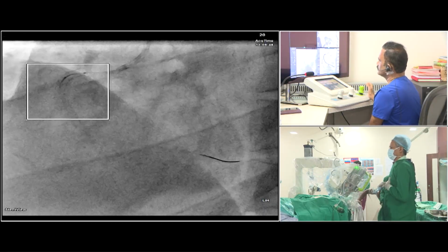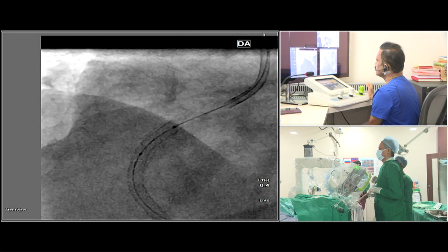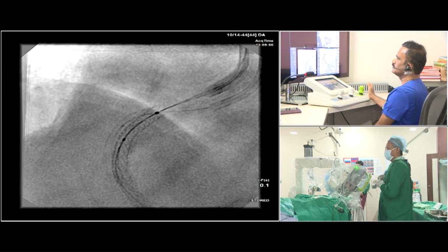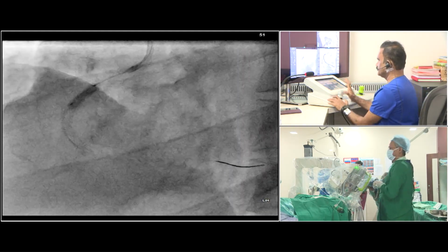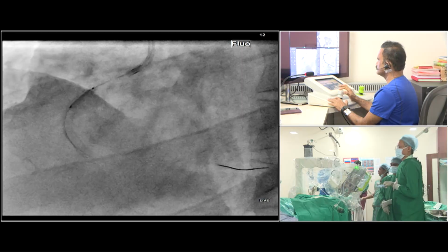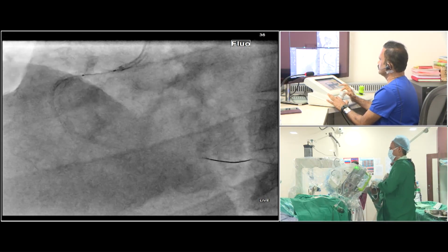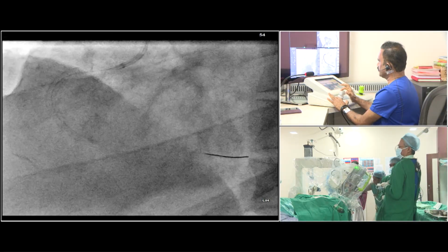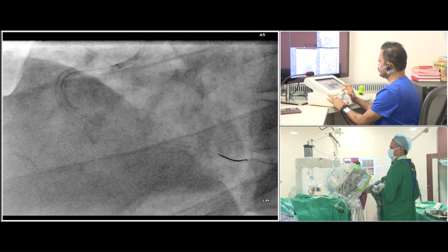Check. Check. Yeah, 12. Going up to the nominal pressure 12. Okay. I am removing the NC balloon 3.5 by 12. We have dilated the stent well at 18 pressure.